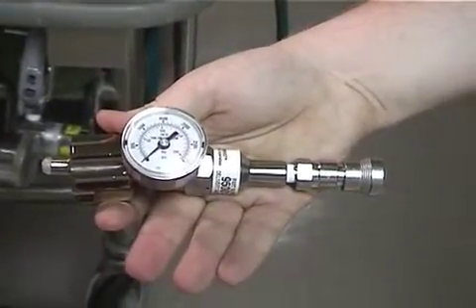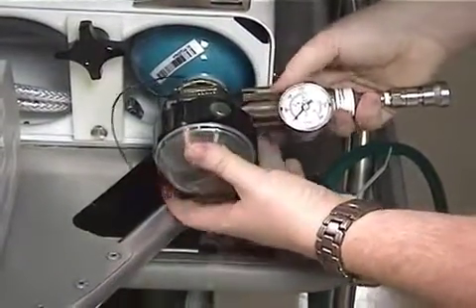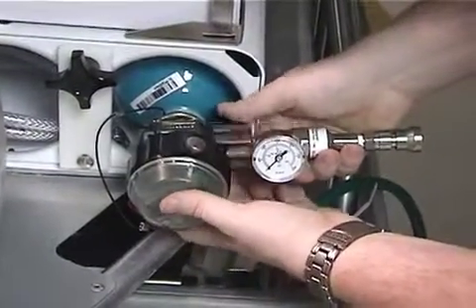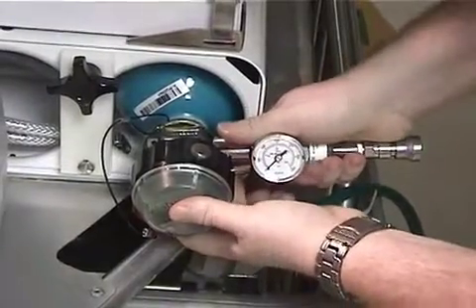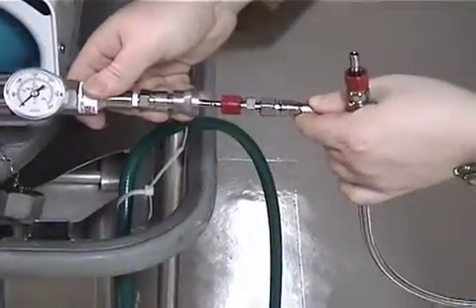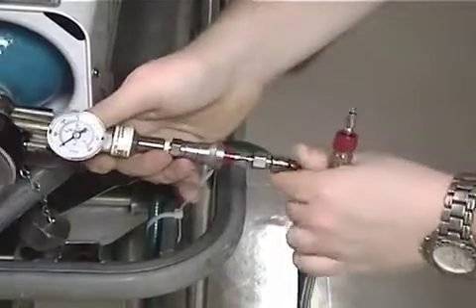Obtain the nitric oxide delivery regulator and connect to the D-cylinder tank and hand-tighten. Next, connect the pressure hose to the regulator by pressing until it clicks and is secure.